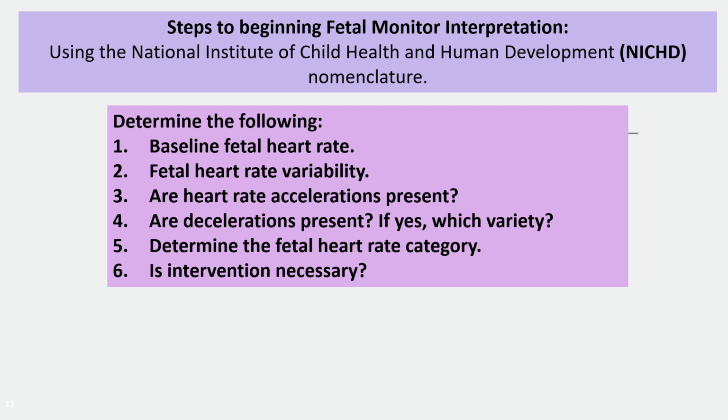Okay, let's talk about fetal monitoring interpretation. The NICHD, or the National Institute of Child Health and Human Development, developed this nomenclature. And I can tell you, if you plan to go into labor and delivery when you graduate, or that's where you want to work, you 100% must know this terminology.